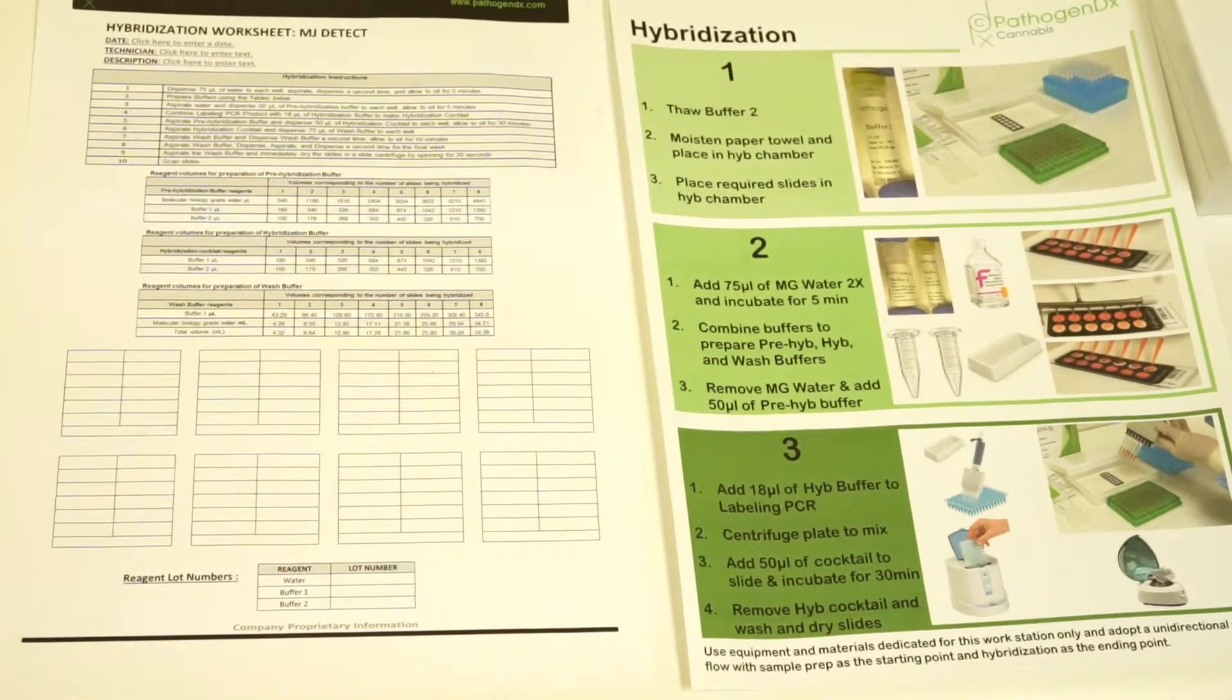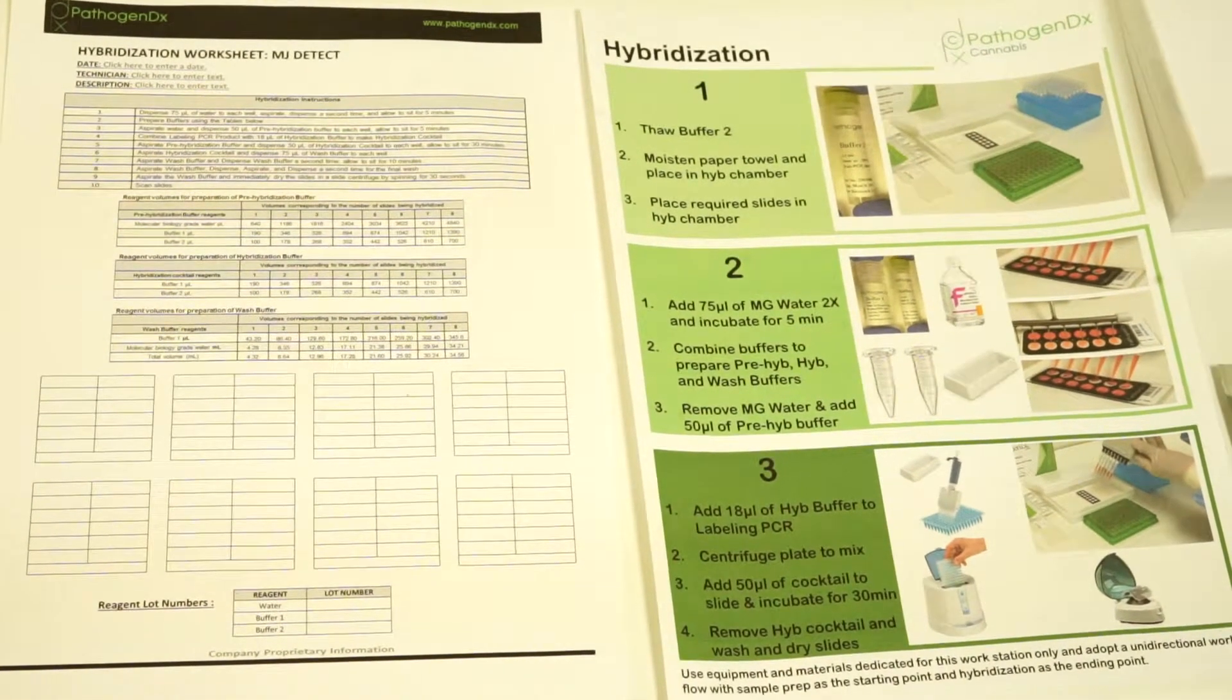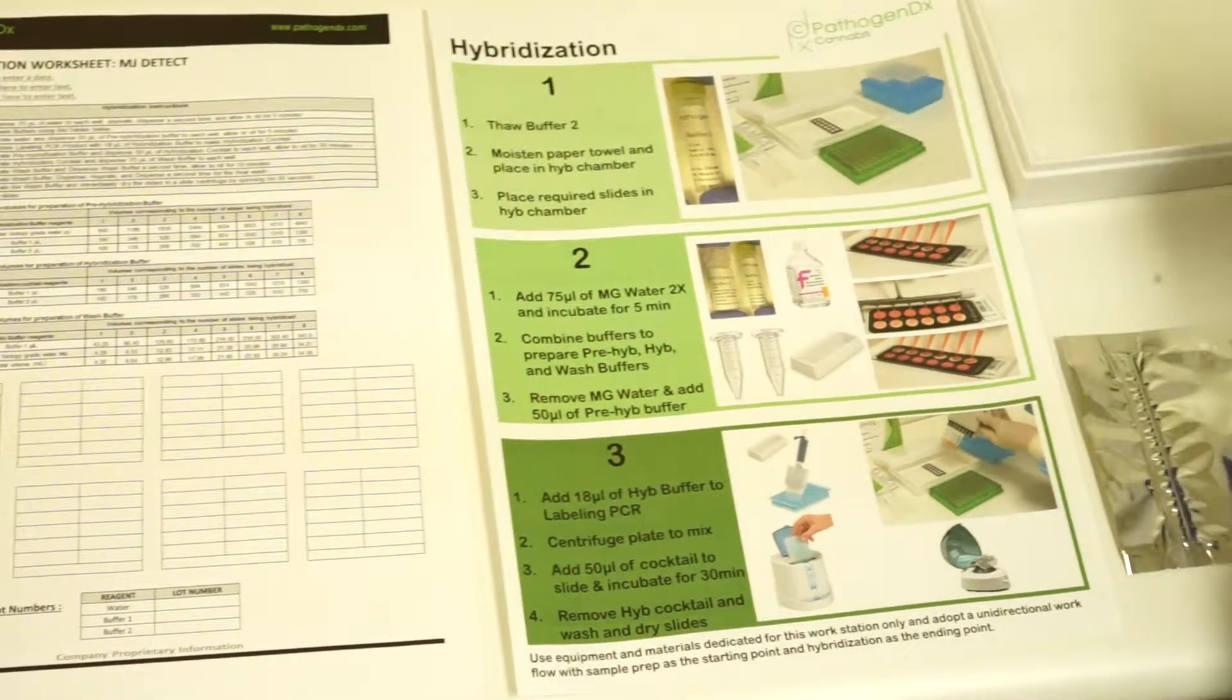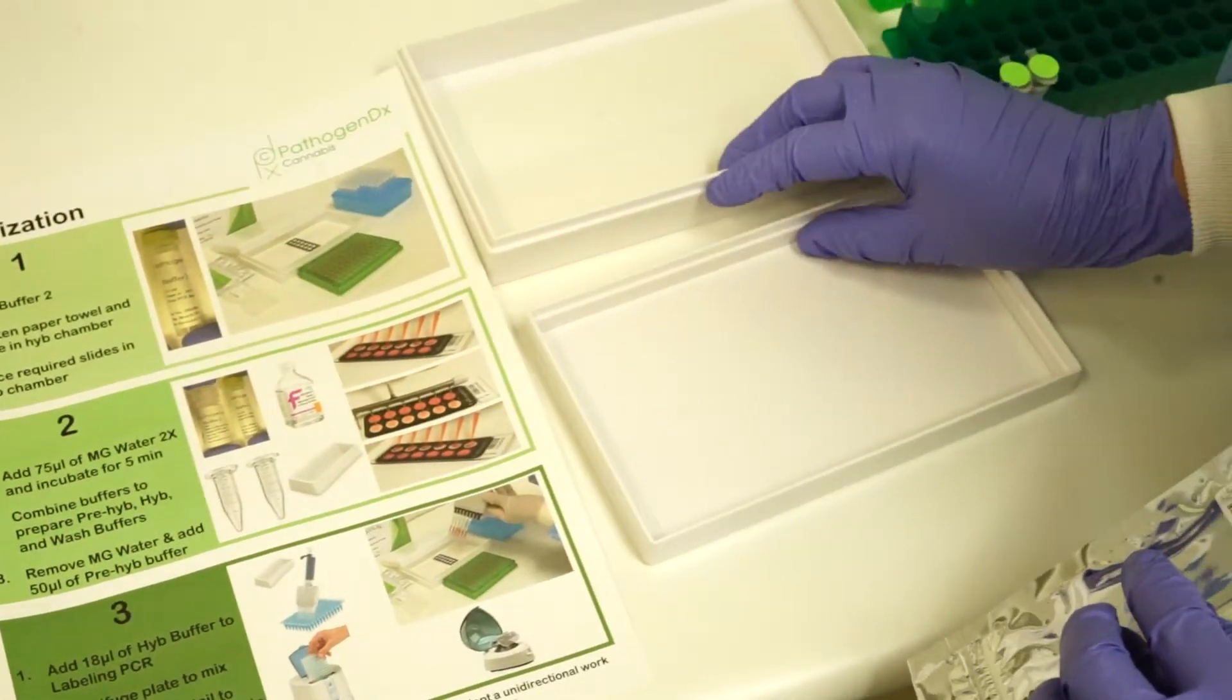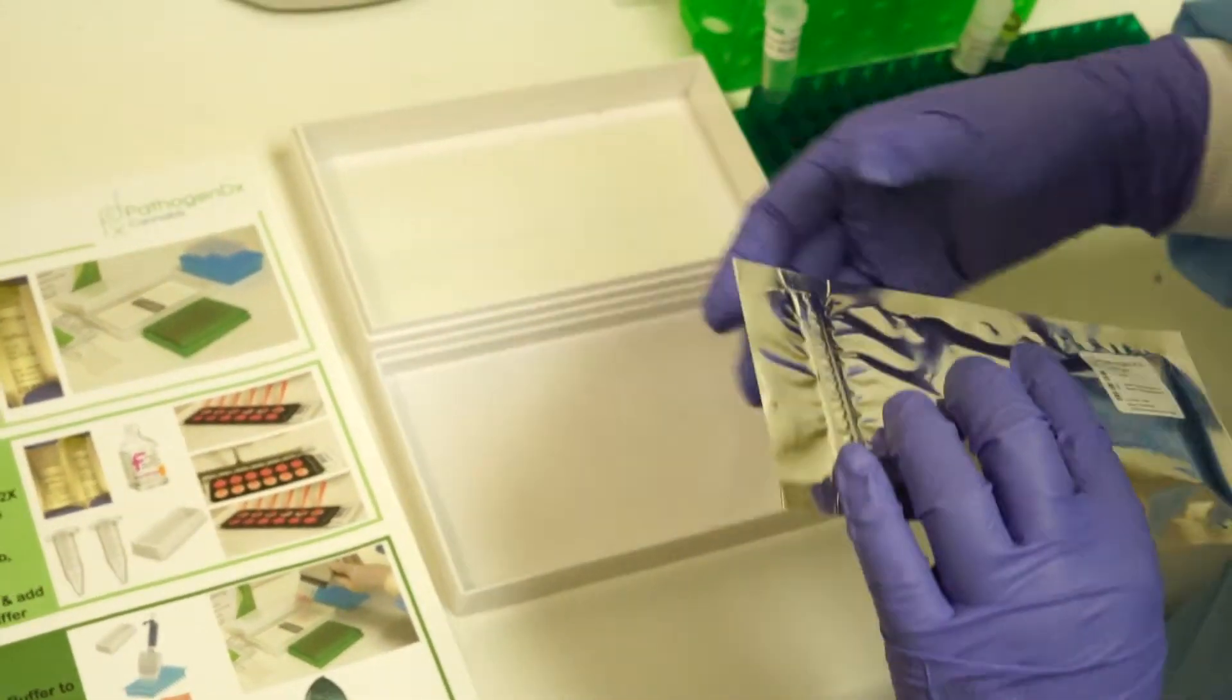Once the labeling PCR is complete, hybridization can begin. Start by making sure your hybridization chamber has a moistened paper towel.